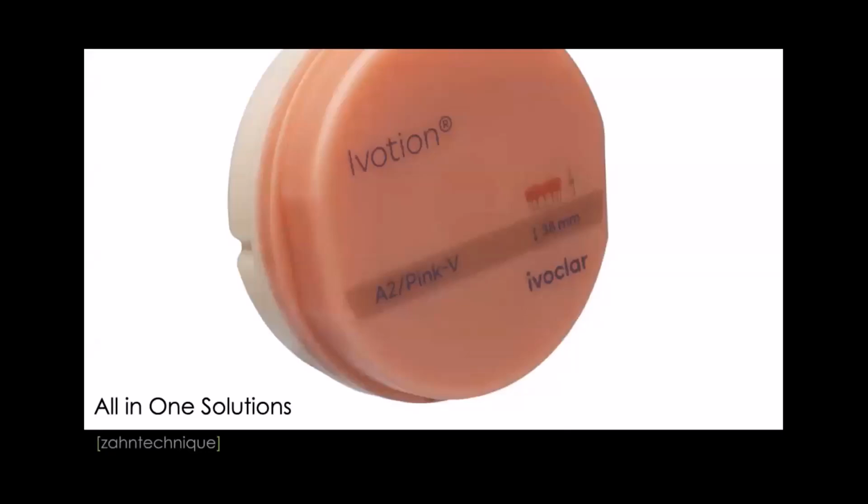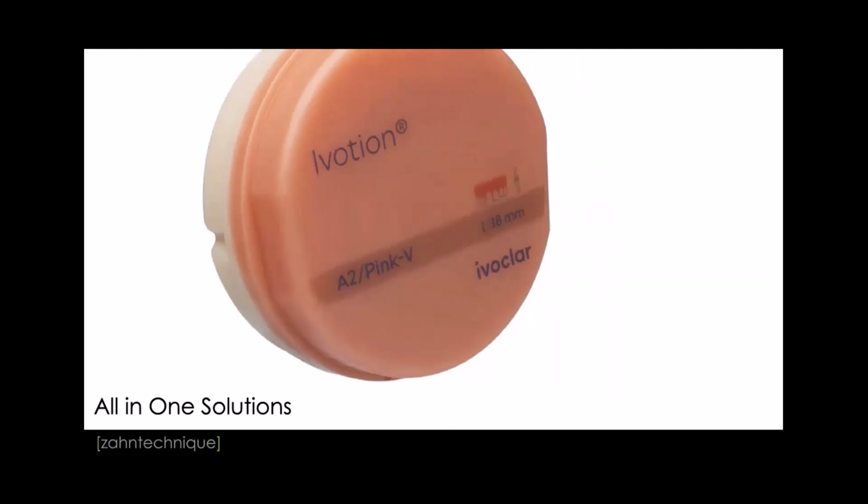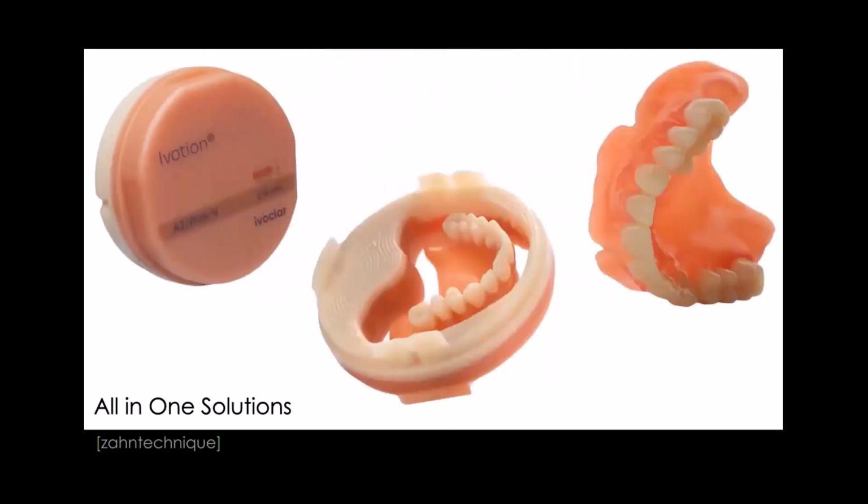It's pretty cool. That's a blank, which is pink, and teeth are bonded together and they have like waves inside. And so we can actually design a monolithic denture and have it milled out of one piece, which is really amazing. In reality, I love it.